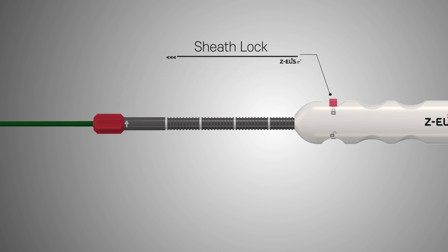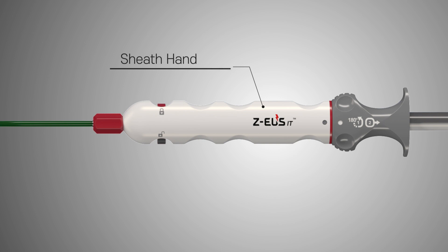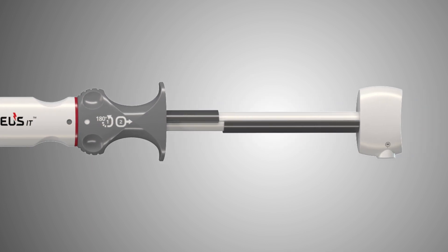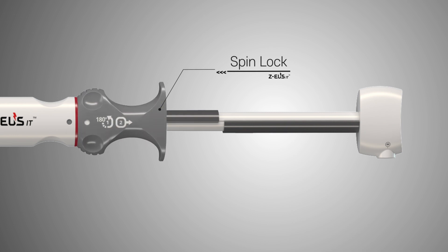The sheath lock is to prevent unintentional puncture before placement. The sheath handle is used to advance the delivery system into the targeted location. The spin lock is to prevent unintentional deployment of the stent. To unlock the stent deployment spin lock, rotate 180 degrees in any direction.